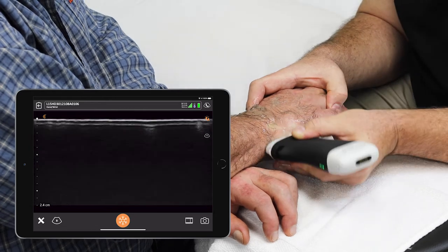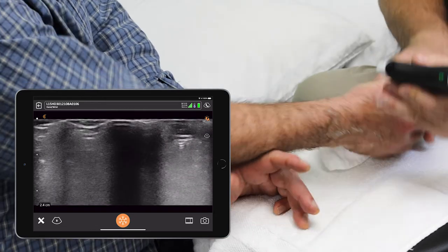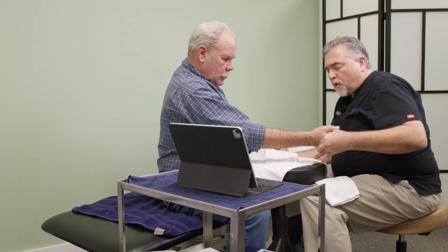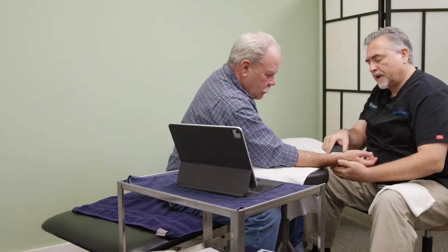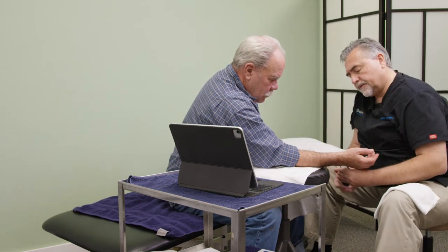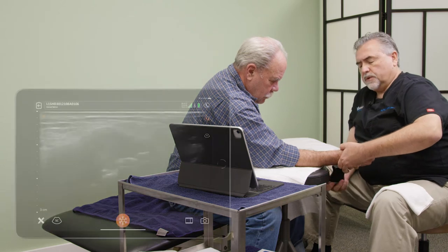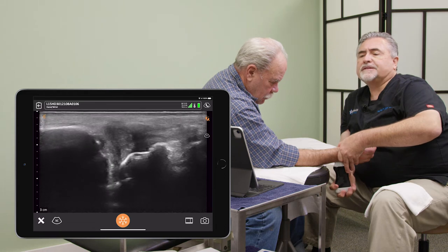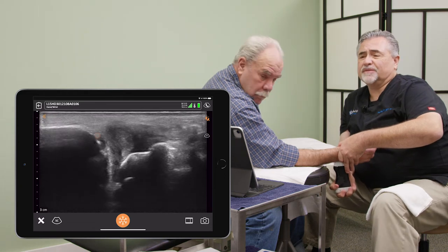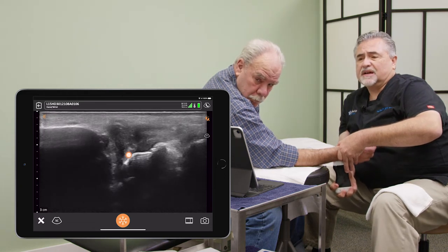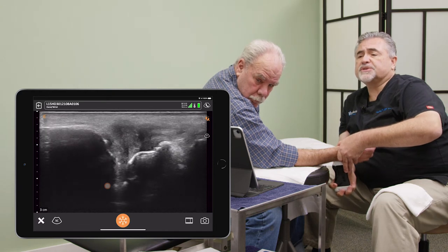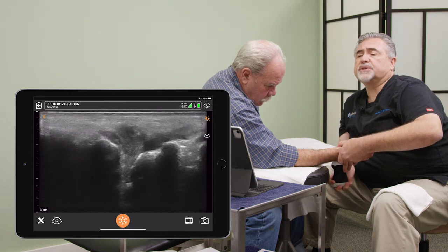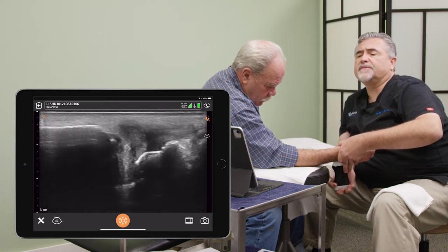I am also not seeing a homogeneous fibrocartilage disc that we would expect. To clarify that further, I'm going to turn his wrist over. Let's have you put your arm over this — there we go — so I can come down underneath. And that's actually a fabulous view of the TFCC. We can see all the way through to the distal radius, so we're actually seeing all of the ligaments associated with the triangular fibrocartilage on that view right there.